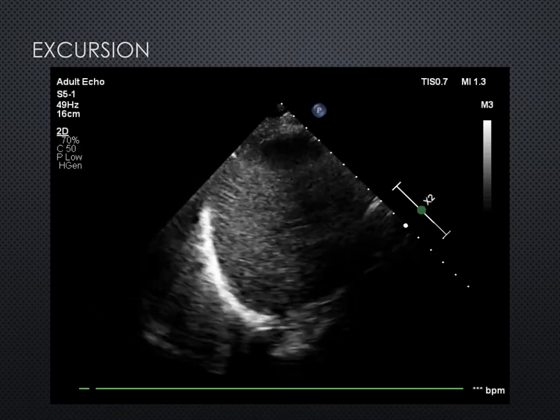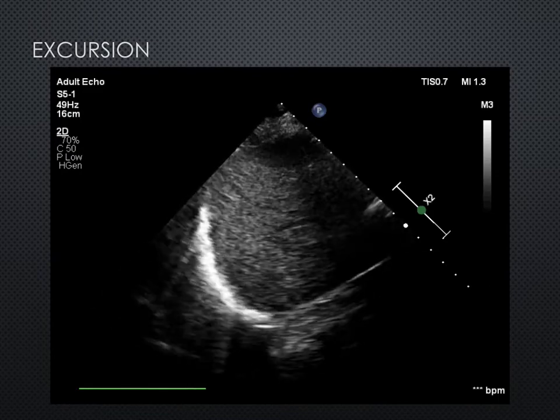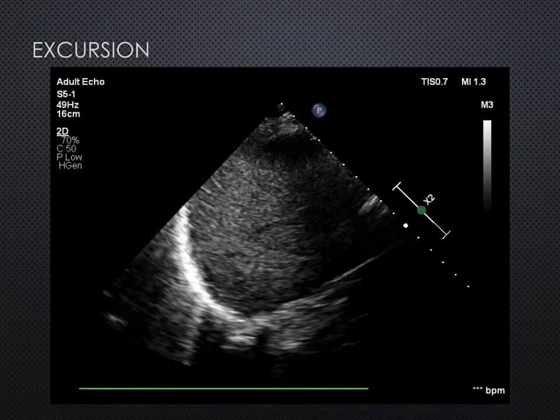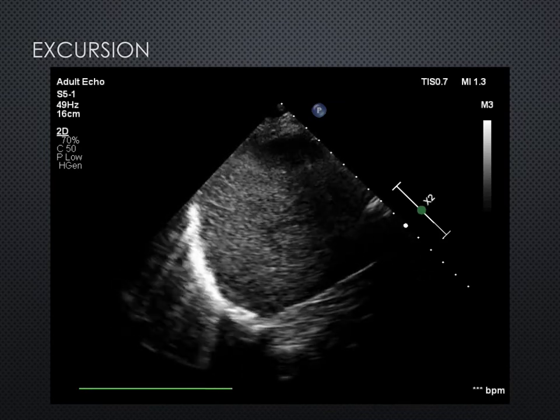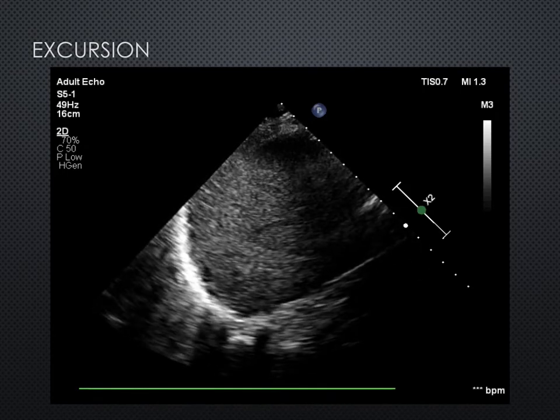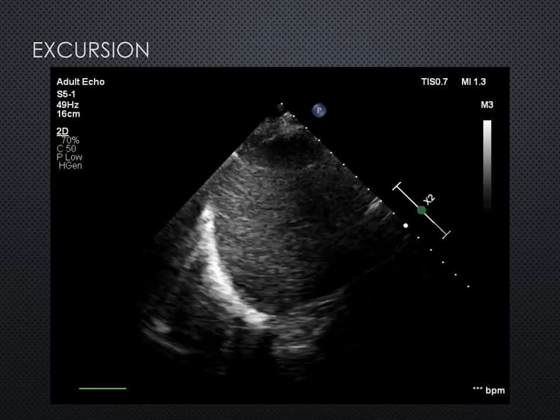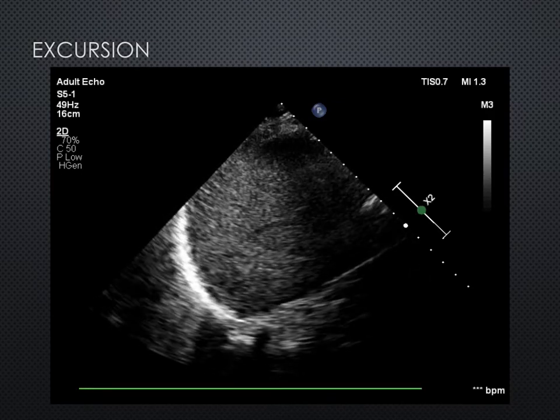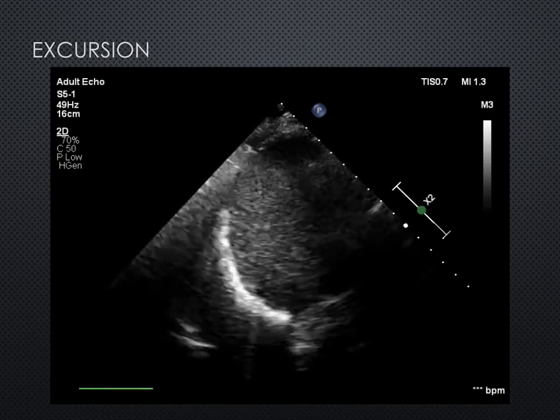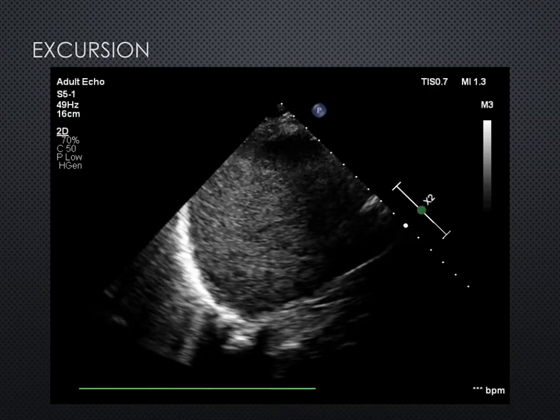So finally, in regards to the diaphragm and some of the artifacts, but also some of the movement patterns that we would expect to see, we need to really consider the excursion or the movement of that diaphragm that we should be observing in normal respiration. You'll see here in the image that's playing on the screen now we've got a little bit of a curtain sign that's coming across, but we're really focusing on the view of the diaphragm in this image, because what we're looking at is, with respiration, how much that diaphragm is moving in the fashion that we would expect with those breaths.